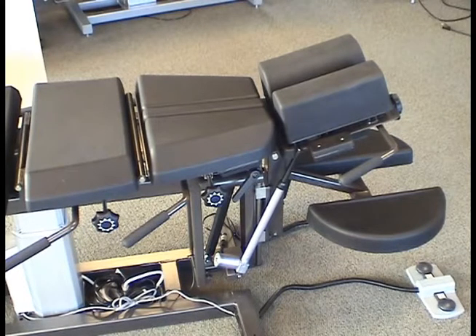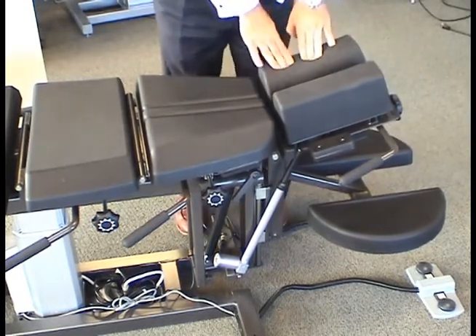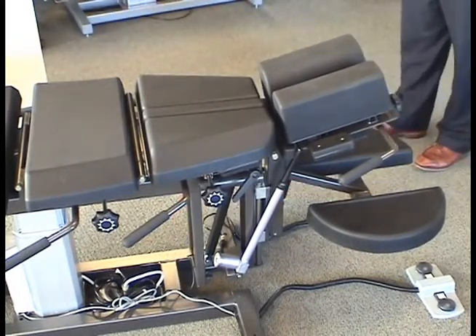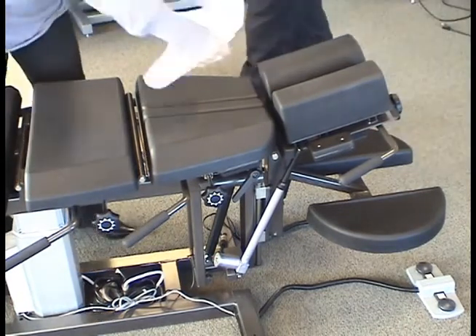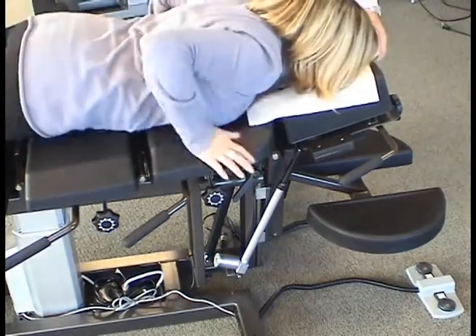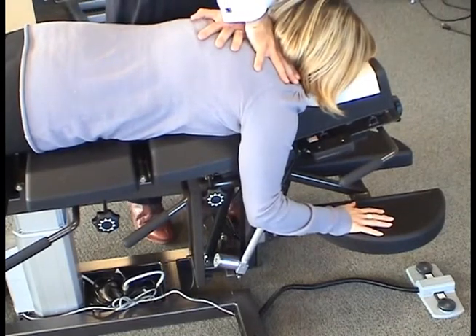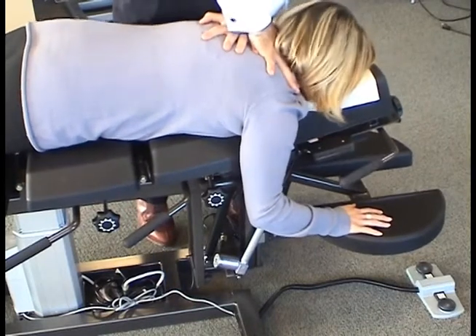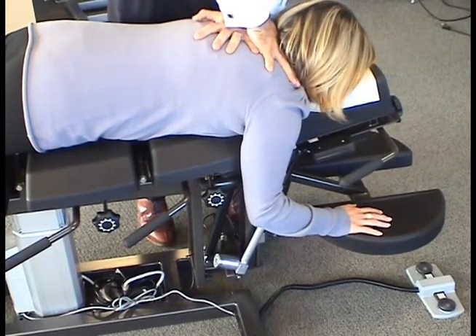The polyurethane pads. This new material will not lose the integrity of its density as upholstered foam does. It is expected that PCT pads will last for years of reasonable use. The densities of the pads have been designed to maximize the pre-stress needed for optimal mechanoreception and thus maximal neurological correction. Therefore, the practitioner needs to apply a force to the spine to take up slack in the polyurethane while following through to complete that drop.